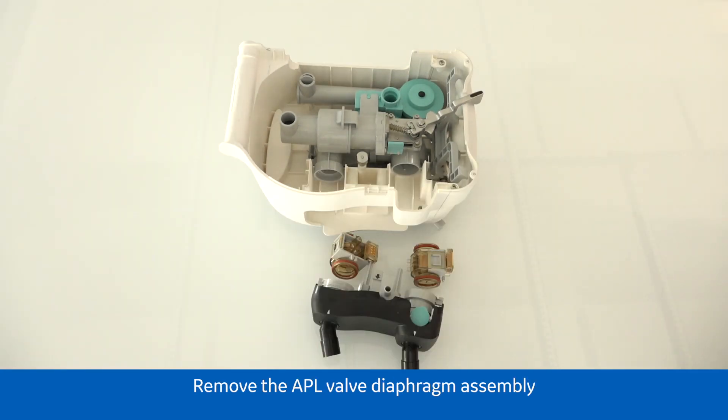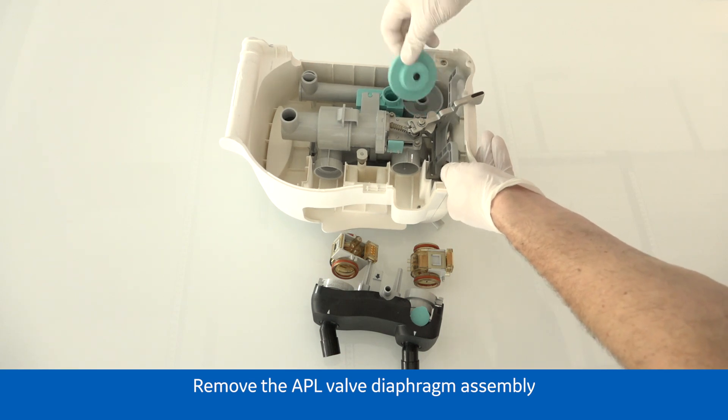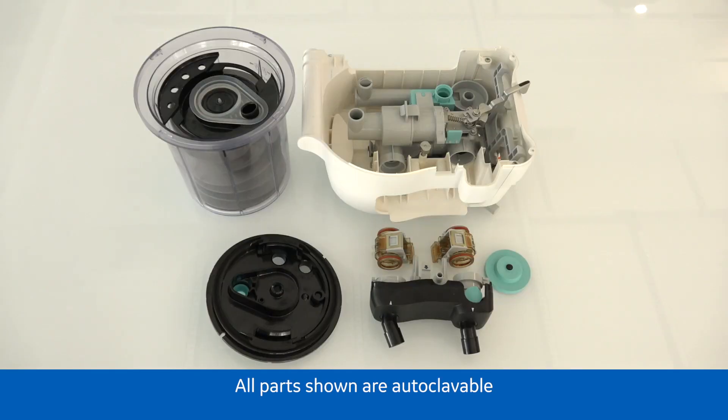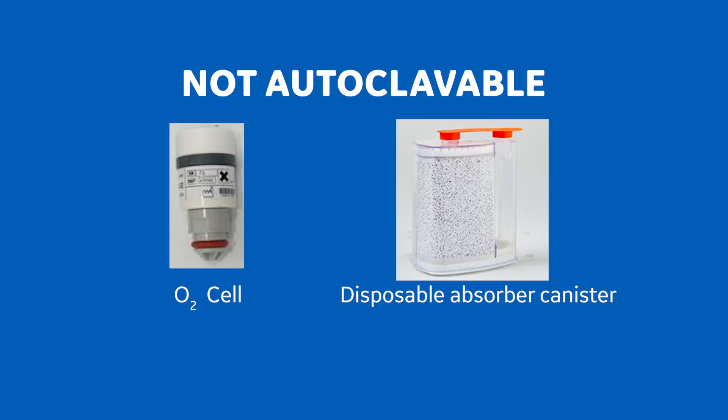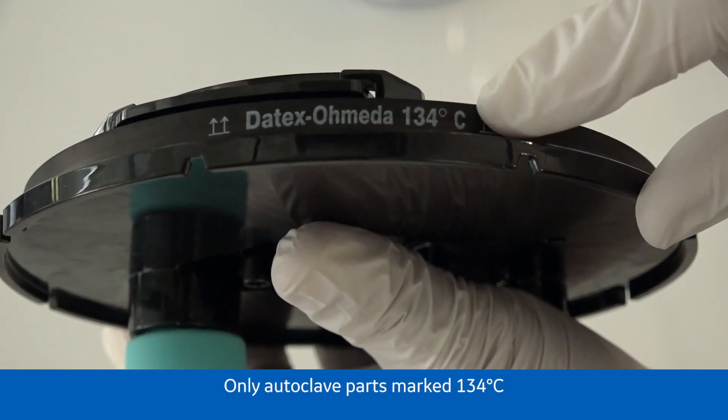Remove the APL valve diaphragm assembly. The parts shown here are all autoclavable. The O2 sensor, sensor cable, and disposable absorber canister are not autoclavable. Only autoclave parts marked 134 degrees Celsius.